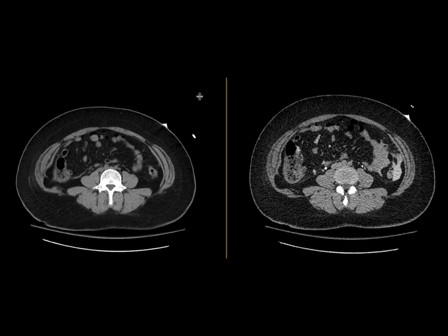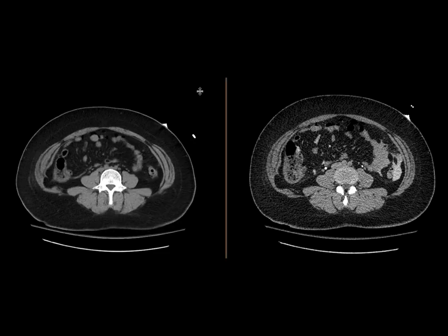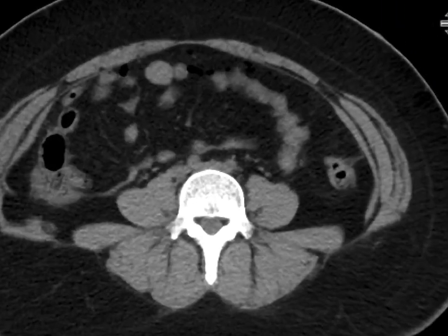This is a patient who came in with trauma, and on the trauma CT had some finding in the pelvis that we were worried about a bladder injury, and so we got a CT cystogram to evaluate it.